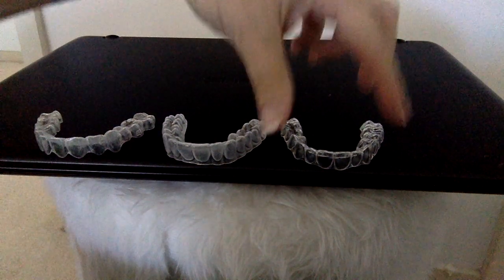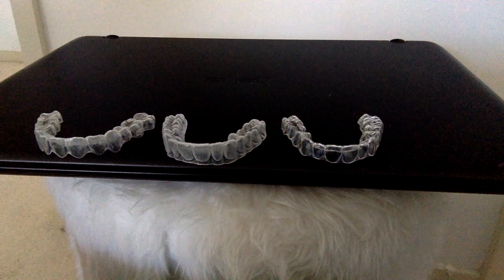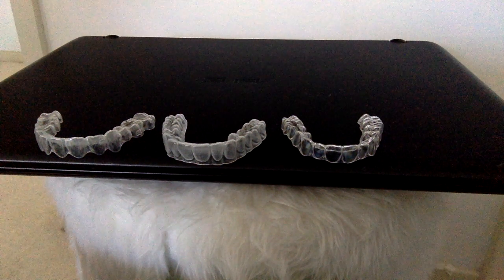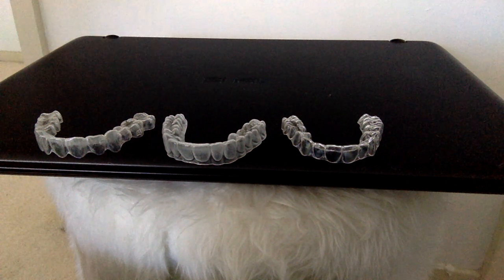This one has a bit of a mystery to me because I don't understand how you can have this kind of hybrid trim line and then also have it be so thin and flexible. I don't think that one's going to work very well, but that's just my opinion. But it's pretty at the very least. So anyways, I just wanted to compare apples to apples here.